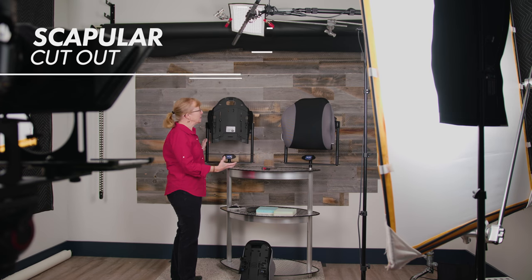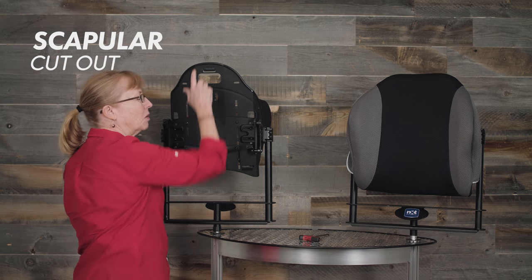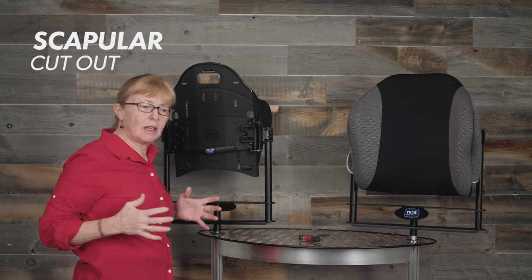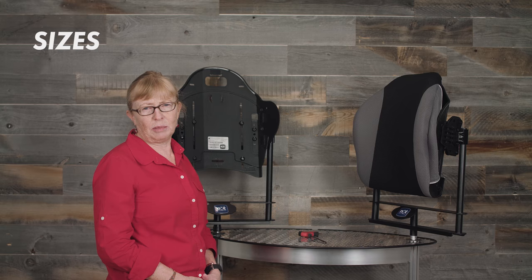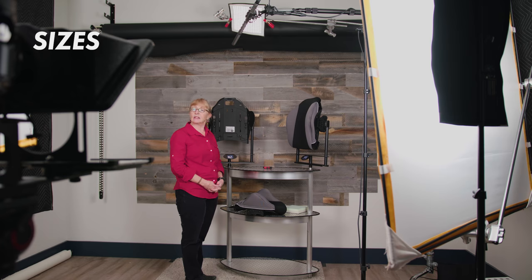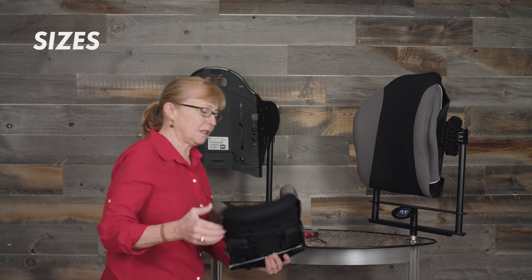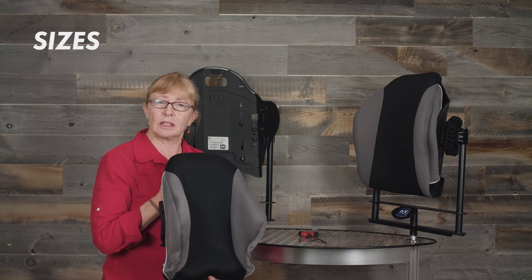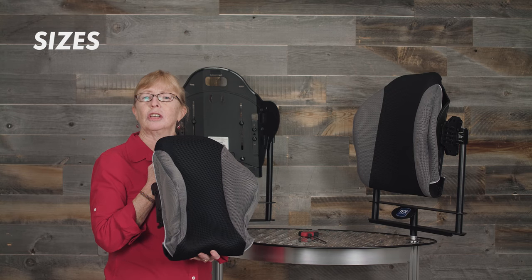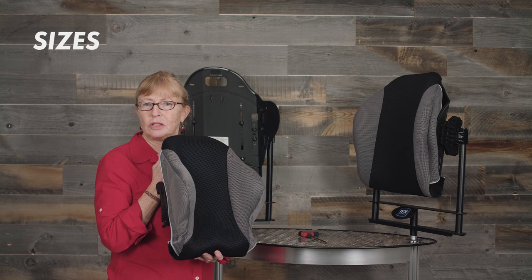All the Xtend back supports also come with a scapular cutout, so if you need back support higher up you don't necessarily impact the movement of the scapula. The Xtend and Xtend deep are available in widths of 16 to 24 inches in 2-inch increments, and the Xtend Low and Xtend Low deep are available from 12 to 22 inches also in 2-inch increments. For instance, this is a 12-inch Xtend Low with a deep contour, and you can see it could potentially be used for a pediatric situation.